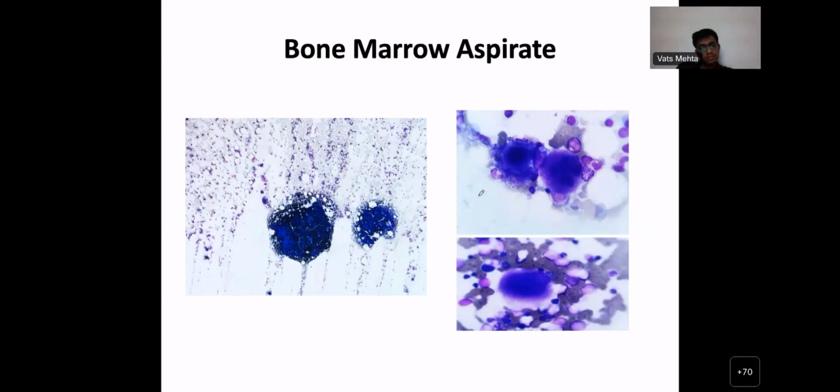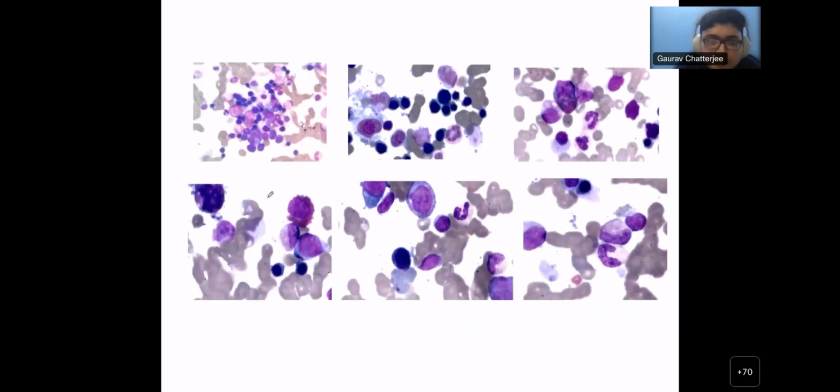You want to describe this bone marrow, Ankit? What do you see? What are these cells? This one, and this, and this. Ankit, what do you think these cells are? So these cells look like megakaryocytes. Yes, of course they're megakaryocytes. Here also you can see some cellular marrow and some megakaryocytes in this part. And when we see on the higher power, there are some erythroids, right? These cells are erythroids. You see some neutrophils as well. So do you see any obvious abnormality in this?